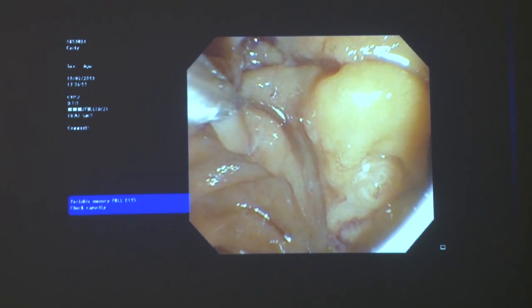This is another one — I call it 'ampulla facing away.' Here, this is the whole ampulla, but the opening is at the bottom and it's facing away. This was a case that had failed cannulation from outside. What I kept doing was pushing on the top of it to bring the opening towards me — keep pushing until you have enough time that the opening is facing you and you can touch it and get in there. Again, I'm not touching the opening until I know I've got the right shot and the time to take it.